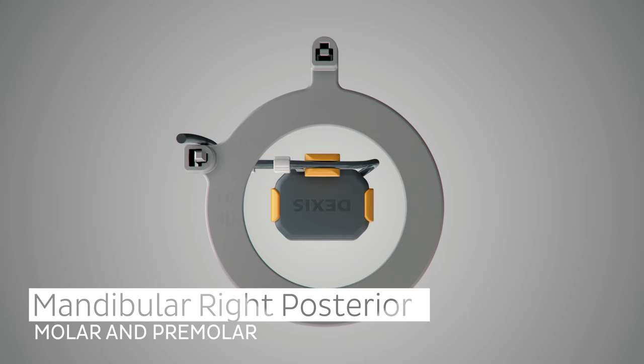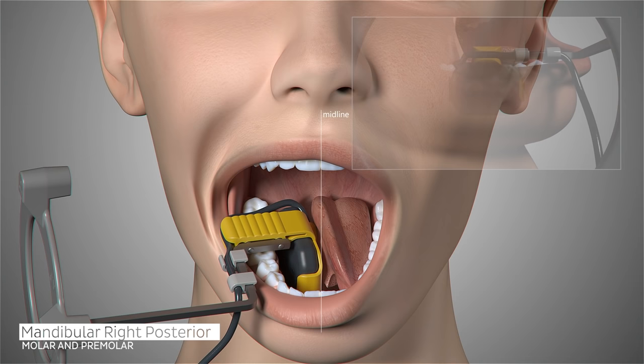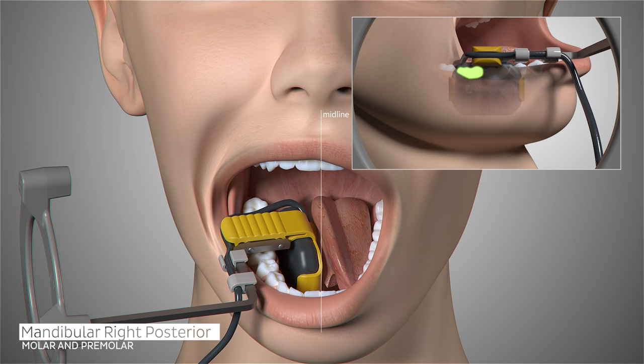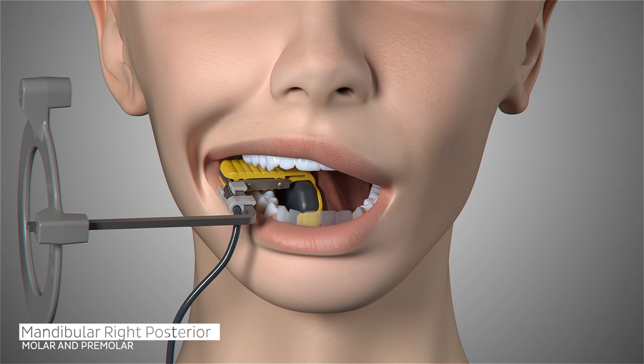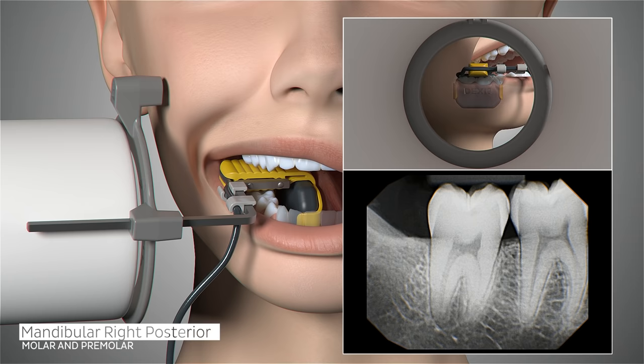The configuration of the sensor and holder does not have to be adjusted for the next set of images in our full series, which begins with the patient's mandibular right molar. Position the sensor so that it is parallel to the roots of the teeth and the occlusal line, centering on the second molar. Place either under or over the tongue, whichever is most comfortable for the patient. Ask the patient to relax and close. Slide the aiming ring as close to the patient's jaw as possible. Place the x-ray emitter cone flush with the aiming ring and trigger your exposure.